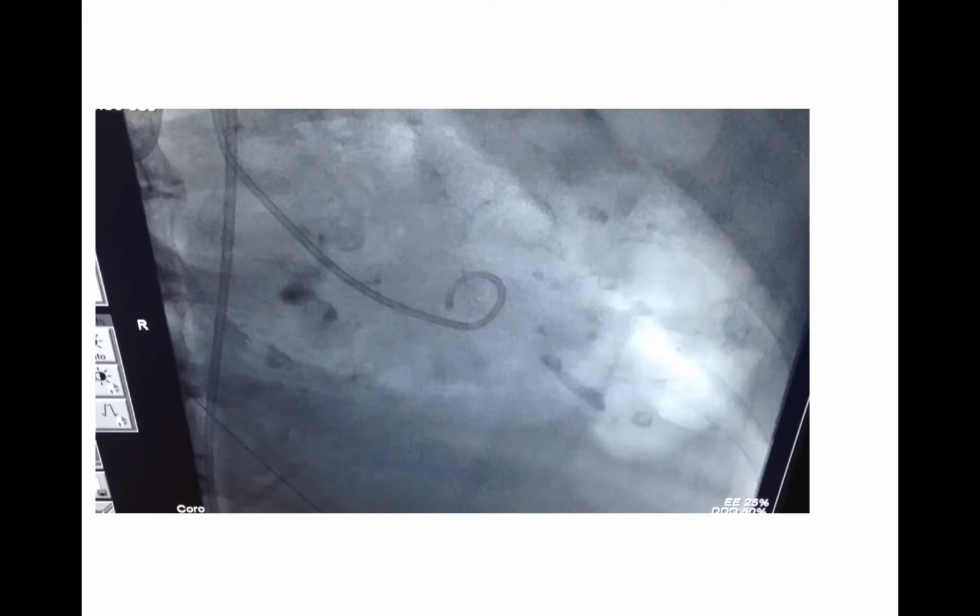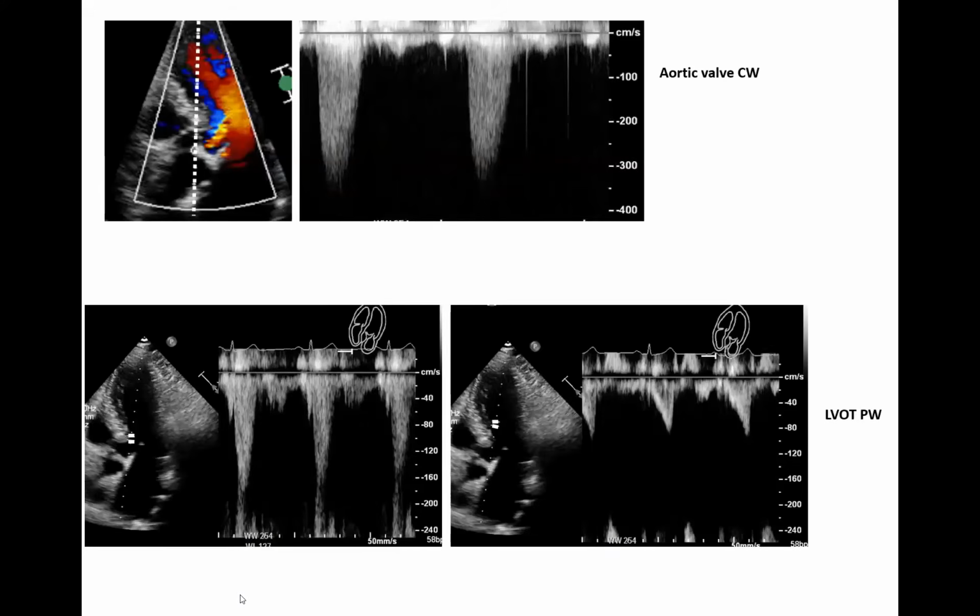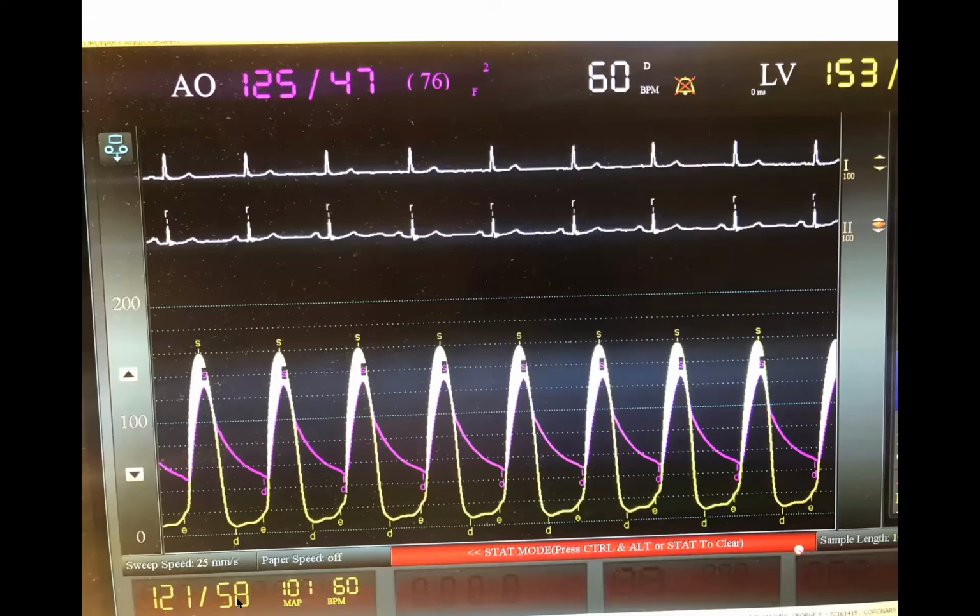Yeah. Swapping the transducer will help though if the damping is occurring beyond the catheter. If the damping is occurring, 1, at the transducer level, 2, in the lines between the catheter and the transducer. Remember, every catheter, every lumen is connected to a different line.